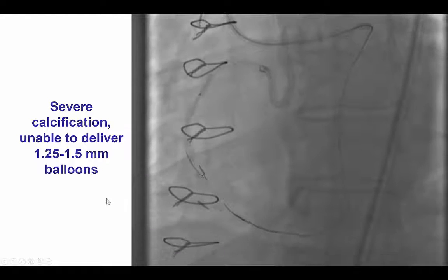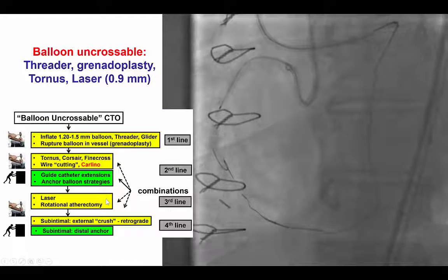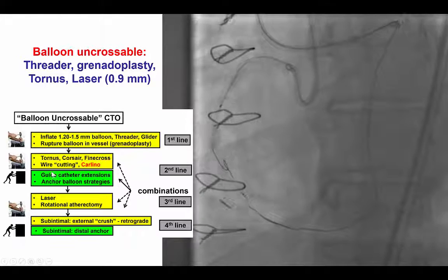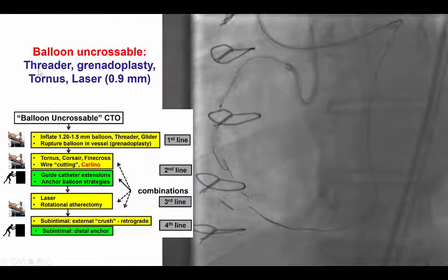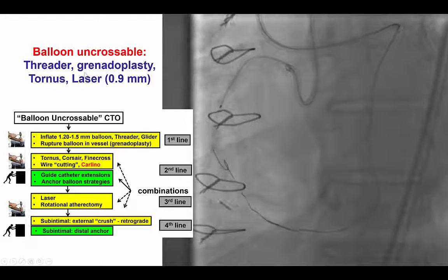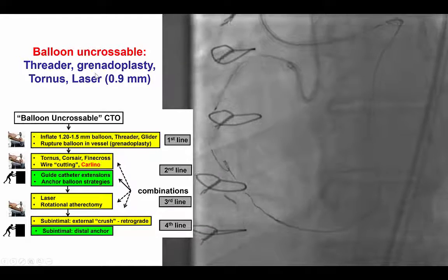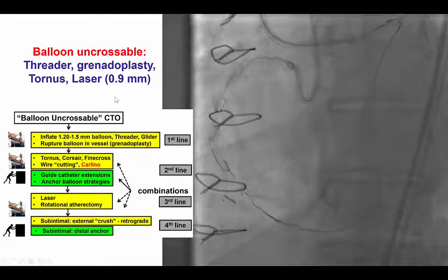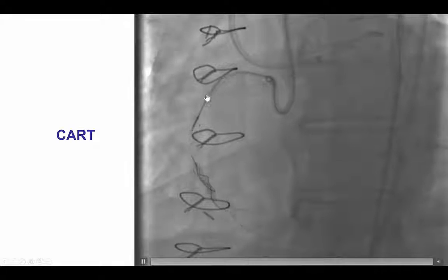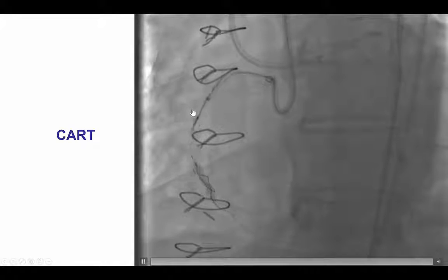We could not deliver even a 1.5 or a 1.25 balloon, so we performed several actions that are part of the algorithm for the balloon-uncrossable CTO. We attempted use of a threaded microcatheter, ruptured the balloon (so-called grenadoplasty), then did injections with a Tornus, and attempted to cross with a Tornus catheter and a laser catheter. After doing that, we were able to partially advance a Corsair into the mid-right coronary artery.